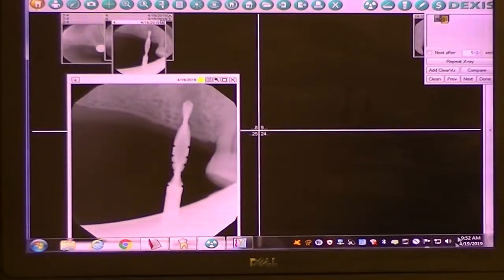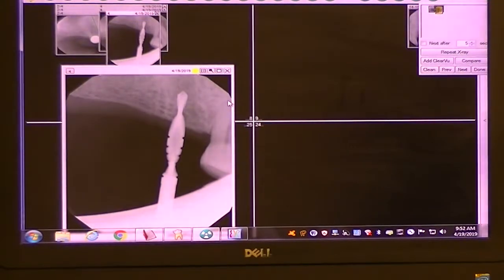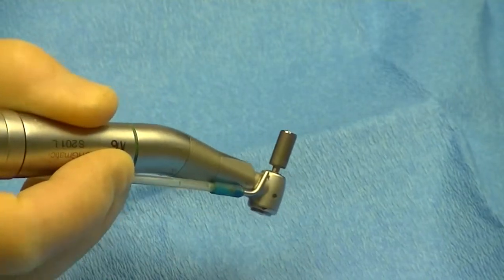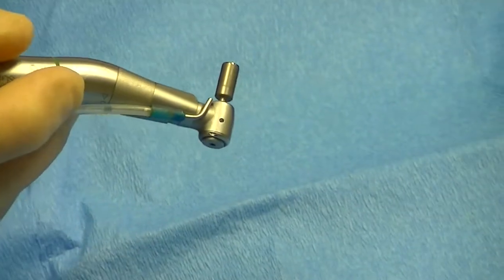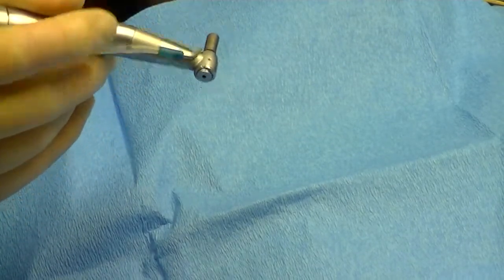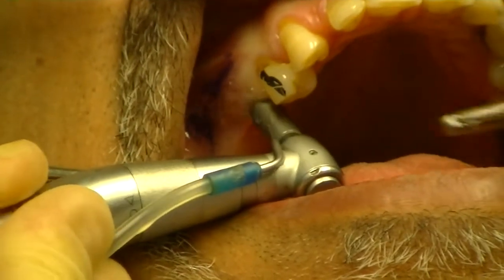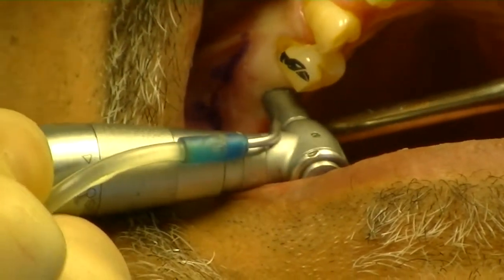Looking at the radiograph — we cone-cut it slightly — but we appear pretty parallel to the natural tooth. Angulation is where we want it. Now we'll use a tissue punch to remove the soft tissue above our osteotomy site cleanly. This prevents putting epithelium into the osteotomy and prevents tearing with subsequent osteotomy burrs. Going to the site, pushing and rotating — I want this incision to be nice and clean.